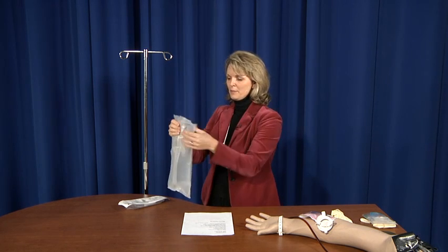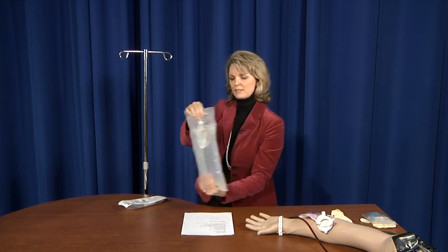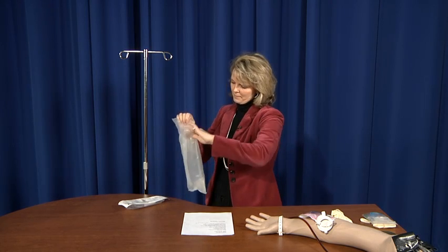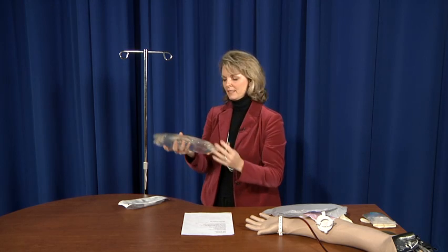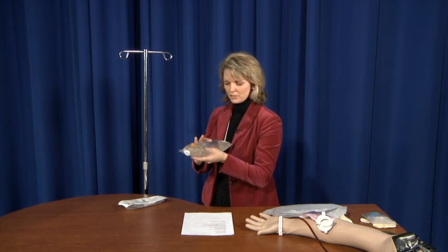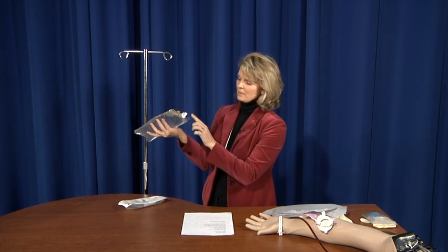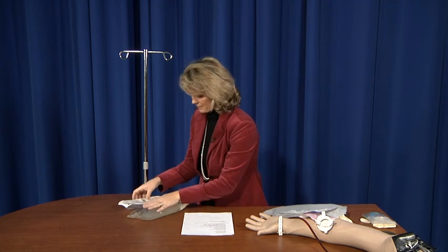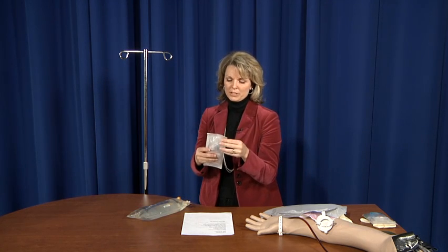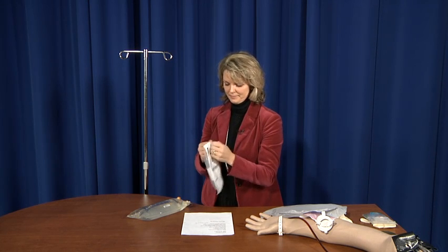You need to open the bag, and you do that by tearing at these little slits at the top. When you remove the bag, give it a gentle squeeze and make sure that there's no leaking. This is what I call the plug. We'll need that in a minute. Then we'll open up our administration set. At the corner it says peel.